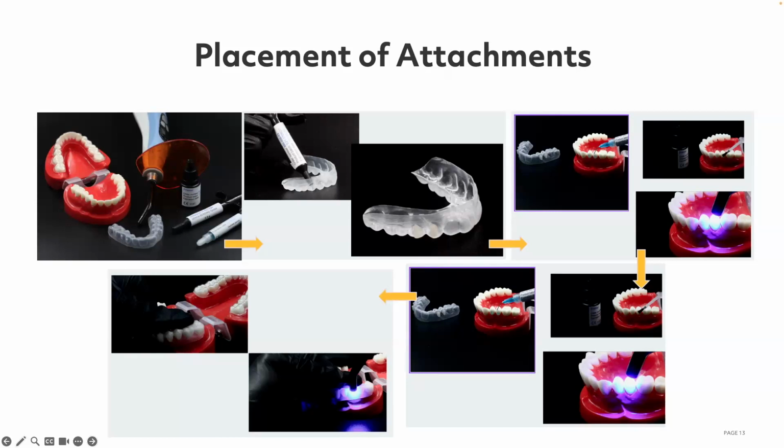Then you prepare the teeth to receive the template with acid and primer, and then cure this primer. After curing everything, you can start putting the template on. And you can see when you put the template on, another thing that you need to be careful about is to never touch the attachment area. Never create pressure on the attachment when you are placing it.